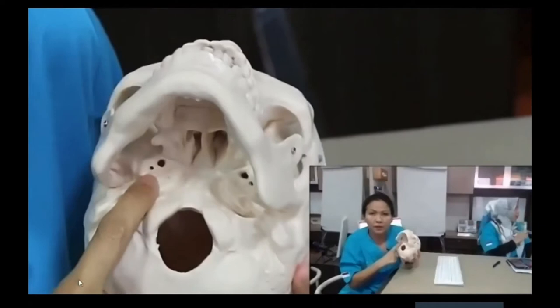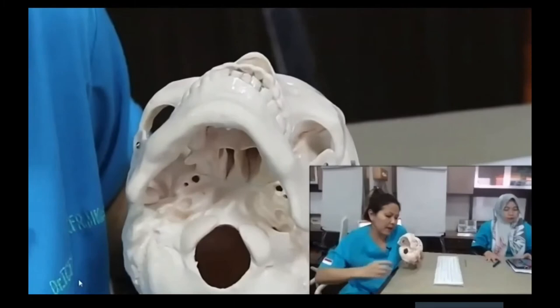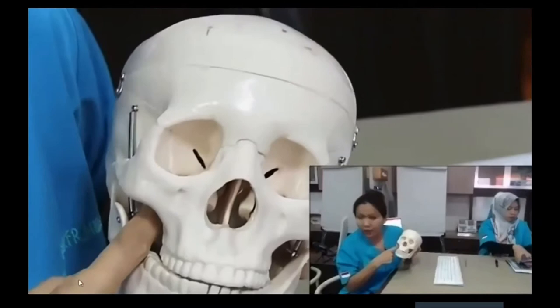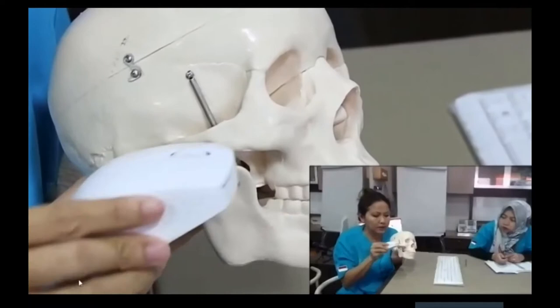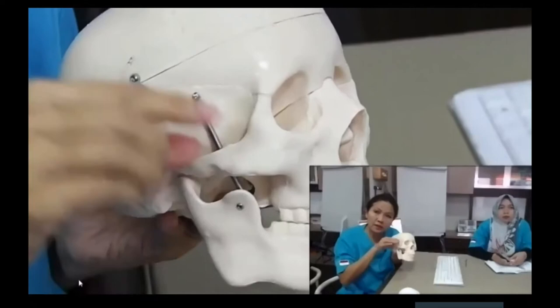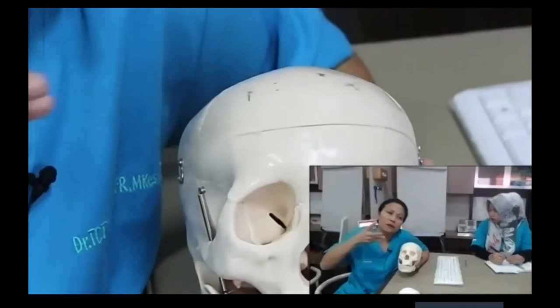Can you imagine it? We cannot enter from this side because this is our neck and spine, right? From the anterior one, we also cannot see anything here, right? From here, also cannot. Because once we put our ultrasound like this, for example, the sound beam will reflect almost 100% because this is a hard structure.